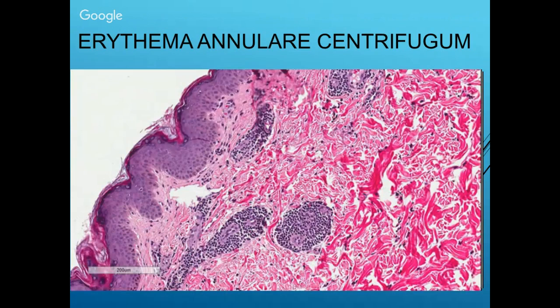It is hugging your wrist actually. So the coat sleeve pattern means that the inflammation is like hugging the vessels actually. So it's like a tight coat sleeve around the vessels. So if you see an inflammation that is superficial and deep perivascular, composed predominantly of lymphocytes, you don't see the other eosinophils. And if you see this tight coat sleeve pattern, then you're dealing with EAC actually.